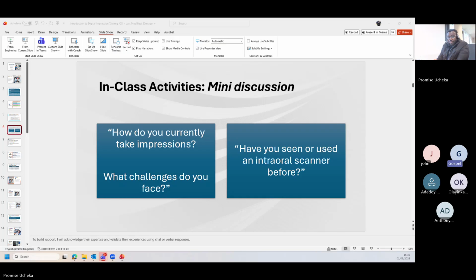Okay, talking about the challenges with the manual impression taking. I think the major one would be the fact that sometimes we waste material, because you may take an impression and the material sets faster before you could seat it in the patient's mouth. So there is always this tendency of material waste from time to time. And at most times it is not as detailed as it should be when compared to the scanner. So I think these are the limitations.